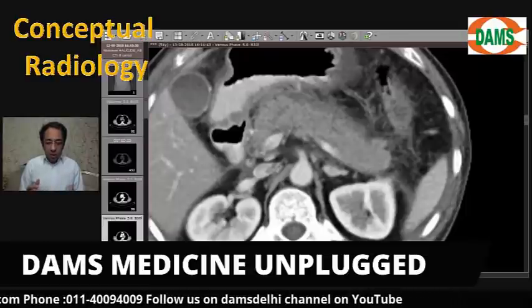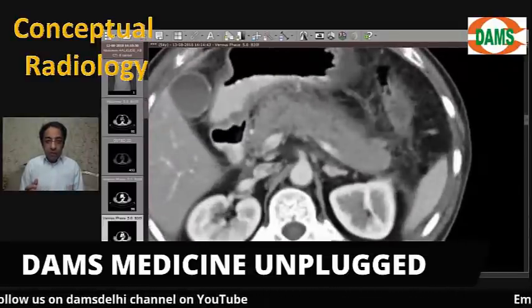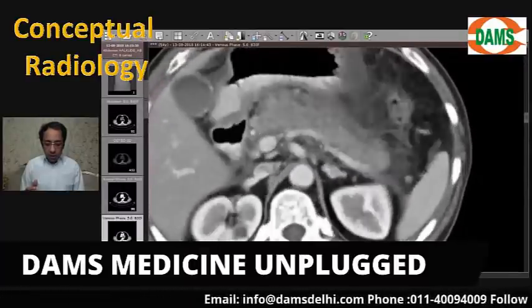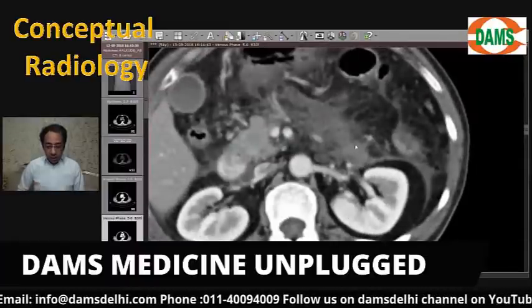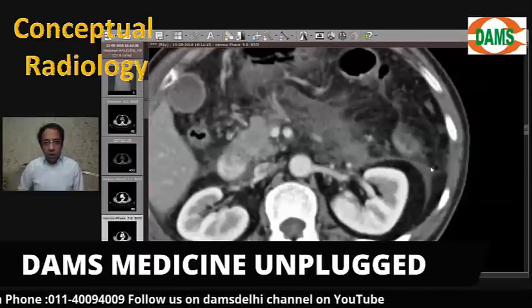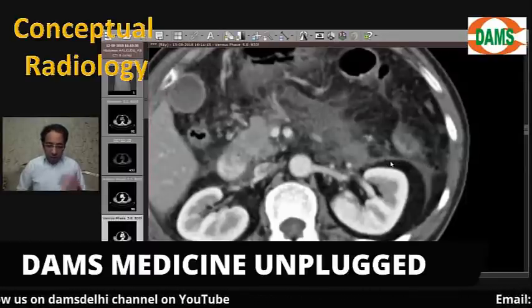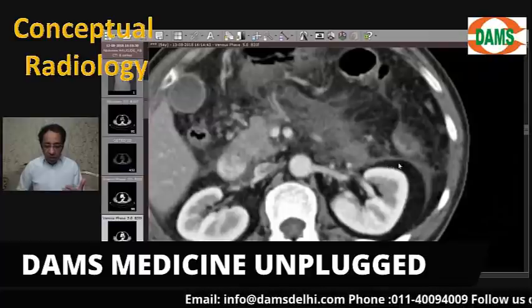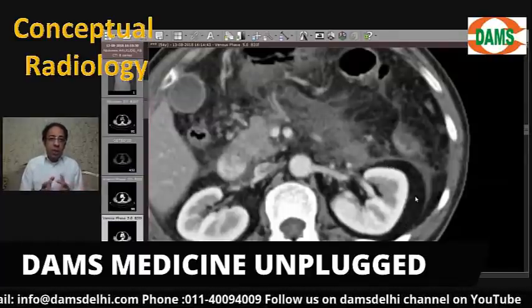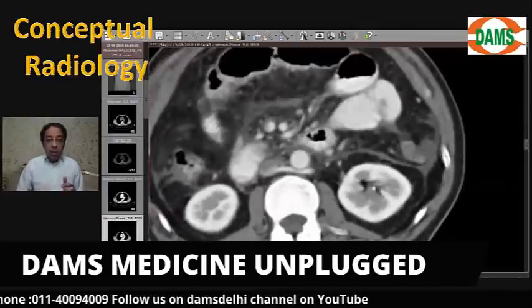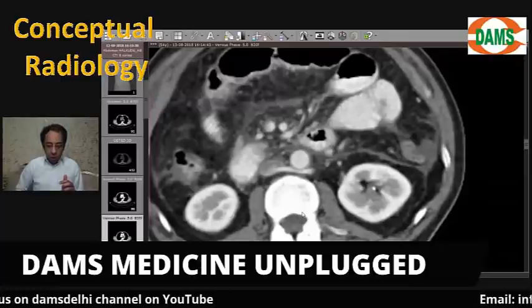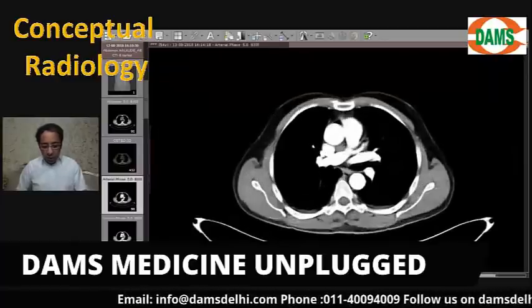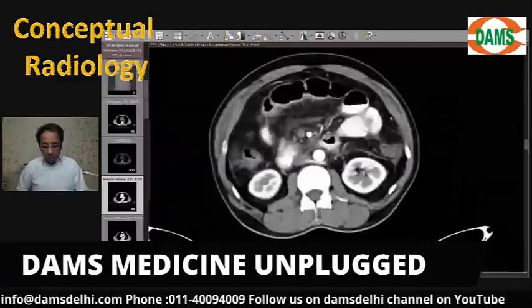Scrolling back and forth through this area, you can see there is thickening of Gerota's fascia. If you now compare the fat in the peripancreatic area and the anterior pararenal space with the fat in the perinephric space, the fat around the kidney is preserved. This is what is called in pancreatitis the renal halo sign - there is thickening of Gerota's fascia with preservation of perinephric fat.